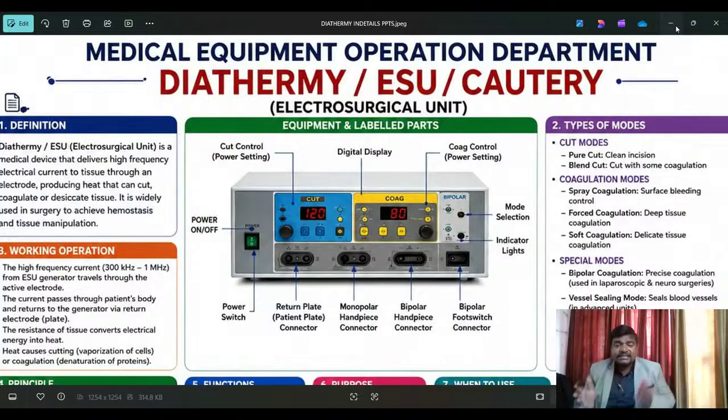After this session, I have to take some rest. Then I can rejoin my job tomorrow. Like that, every equipment also needs rest sometimes, and we have to implement and practice preventive maintenance. Calibration is very important. Then we can protect and reduce the complaints, and sometimes we can find out the issues before connecting the patients and before receiving a complaint from the hospital.